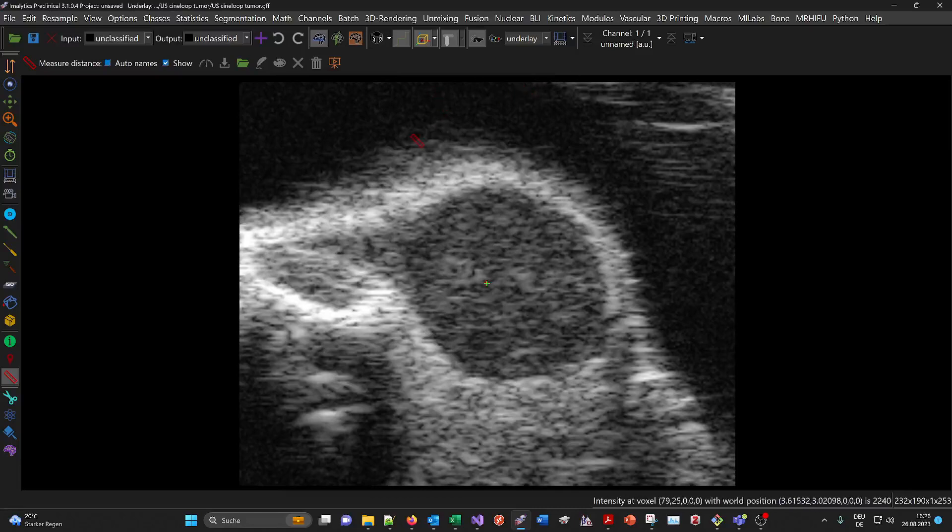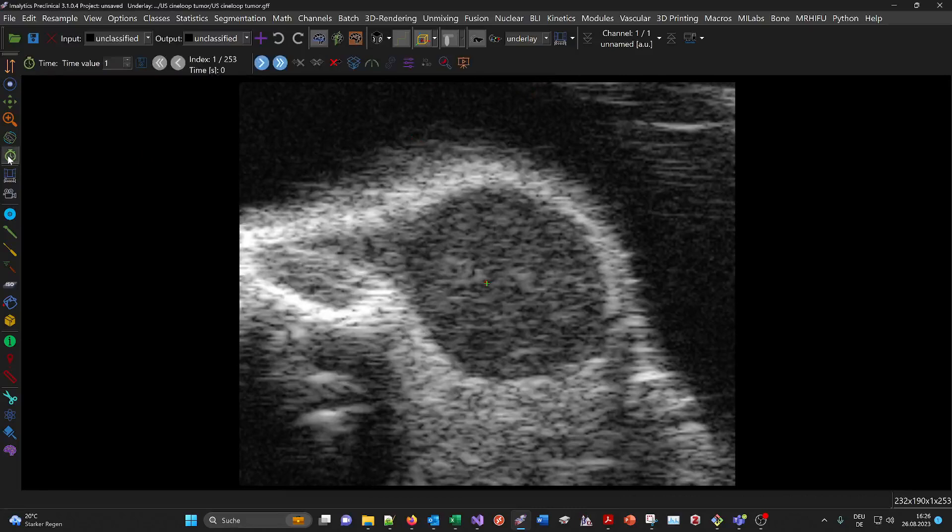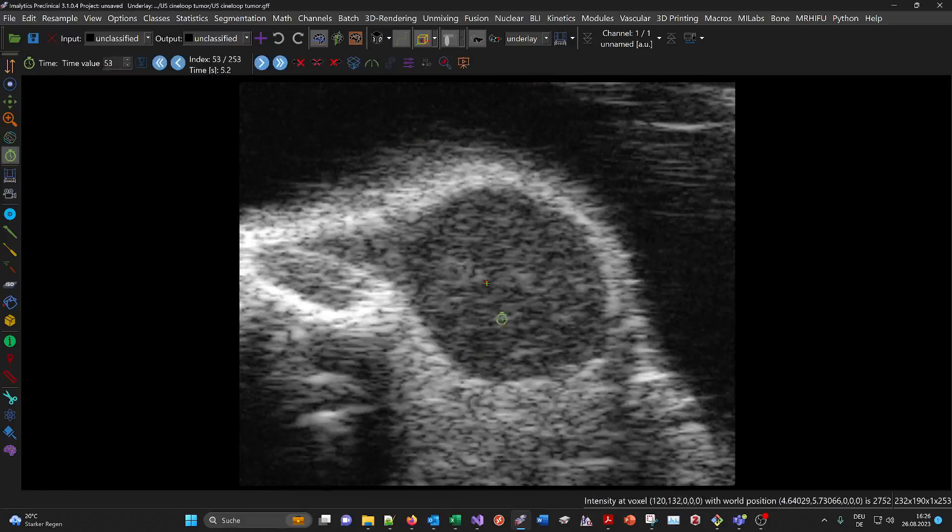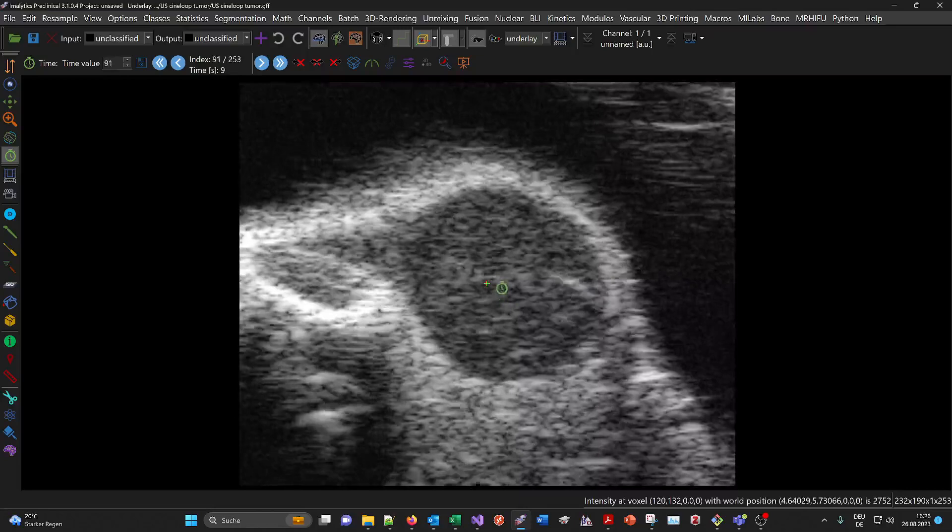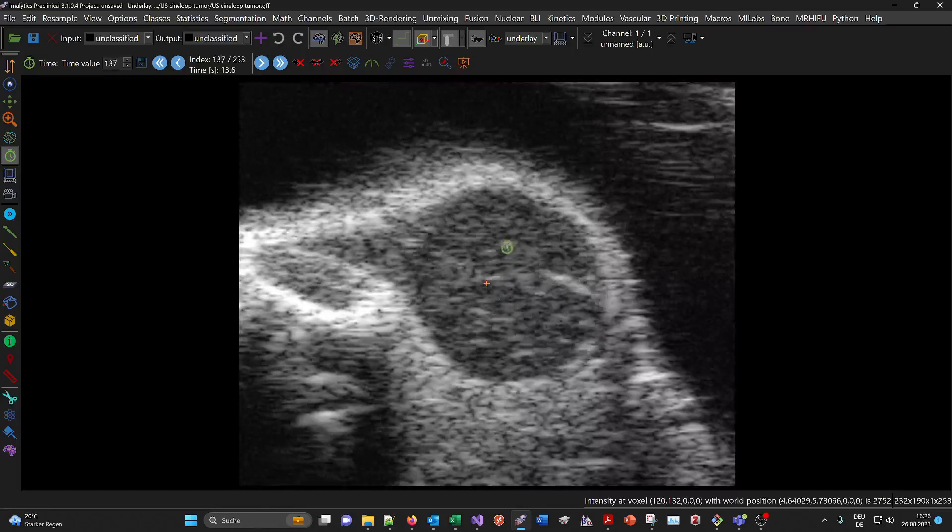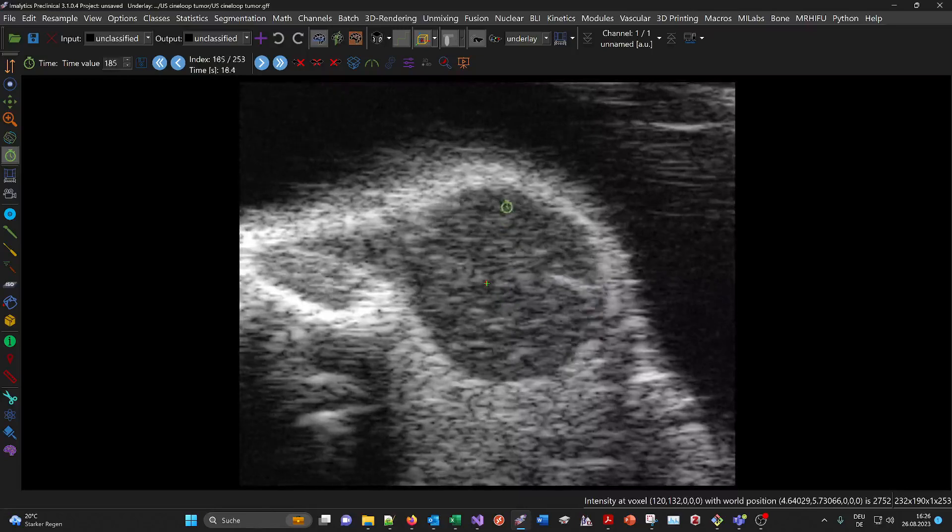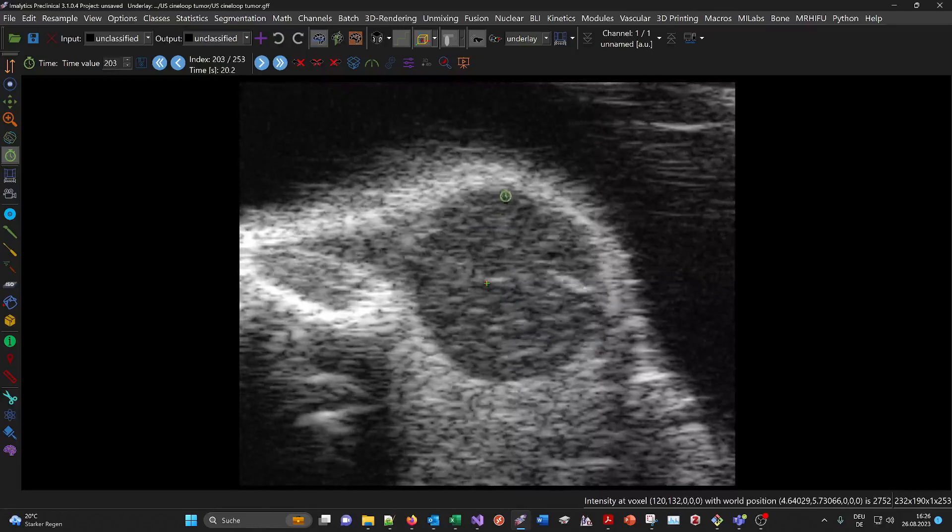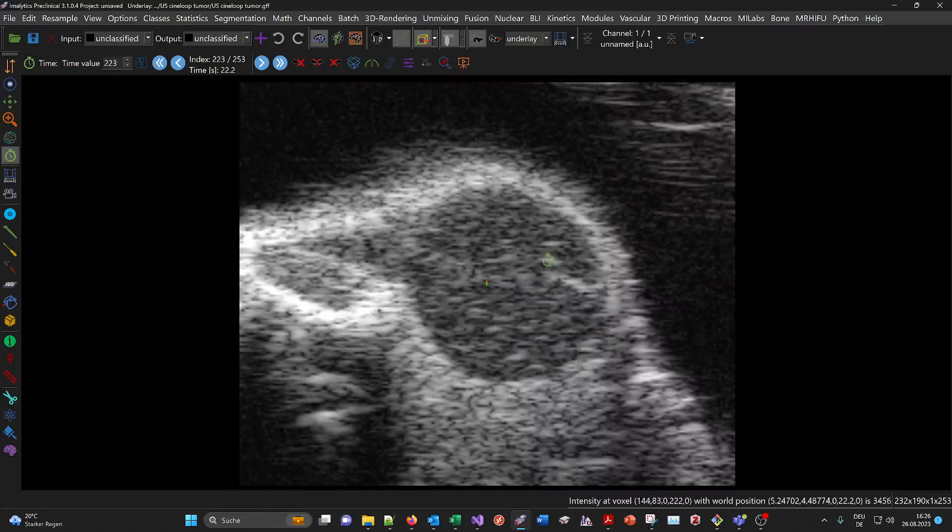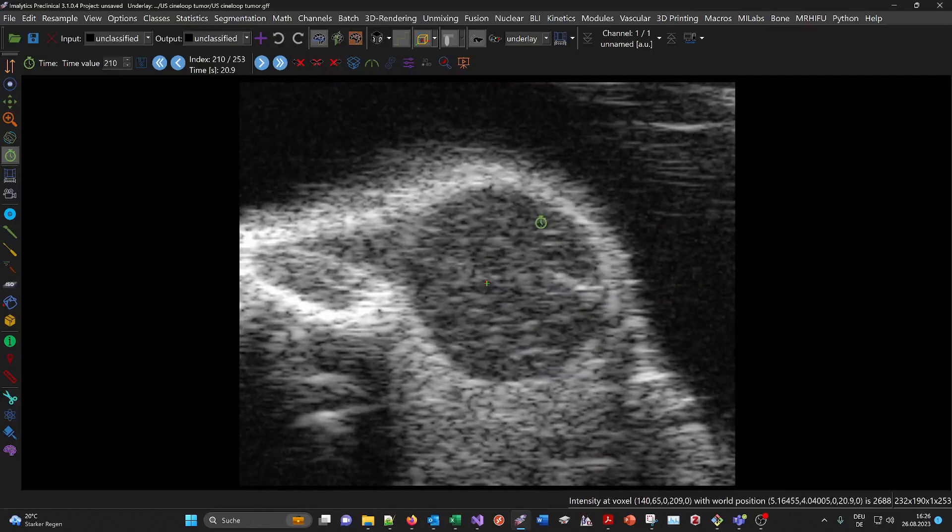Since it's a 4D dataset, you can use the time mouse mode here and go through the time by dragging the mouse. You'll see microbubbles appearing in the tumor because they were injected during the scan.